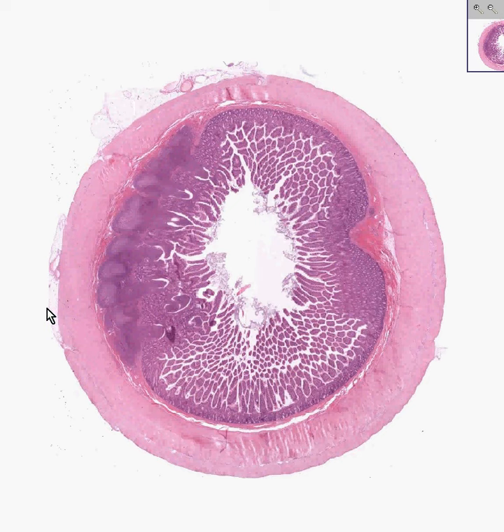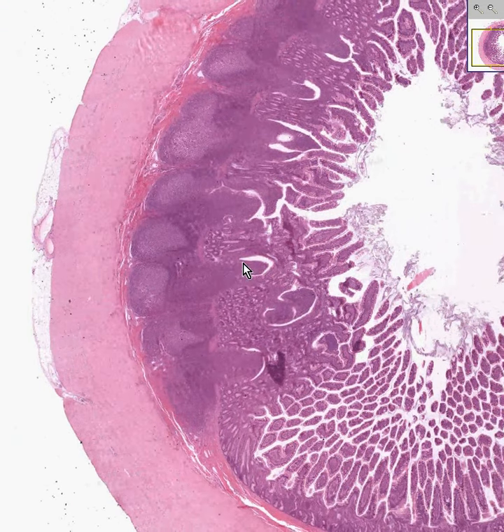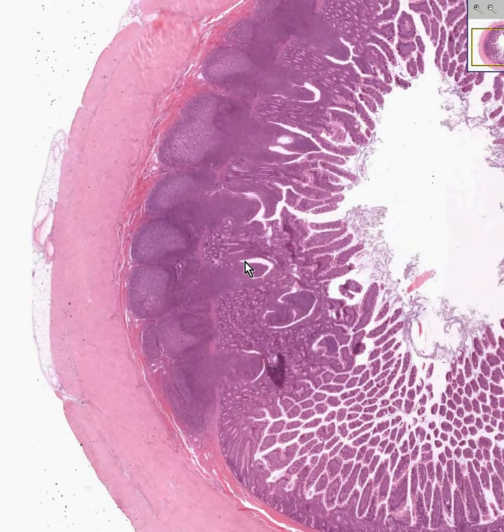So if you look closely, you may see some mesothelial cell linings on the surface, which I hope we will see. Otherwise, let's review the classical layers, and it really doesn't matter where we start. Also, I don't think it's that important that we differentiate histologically between ileum and jejunum. Let's just say there are a few subtle differences.